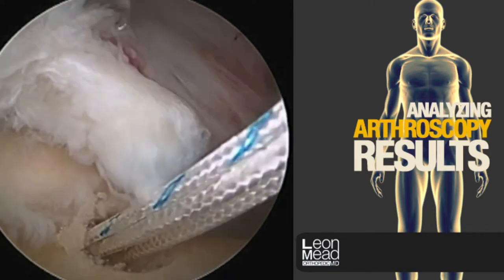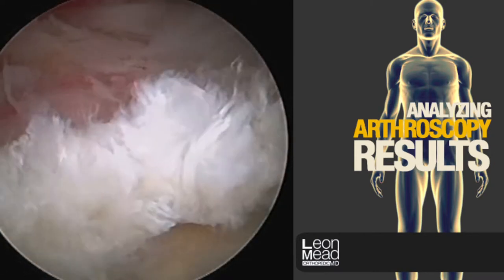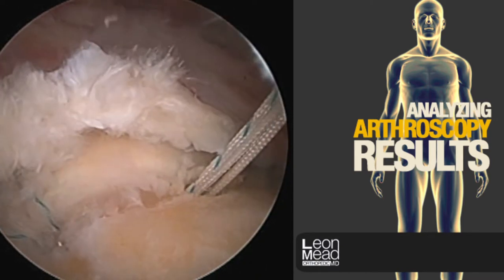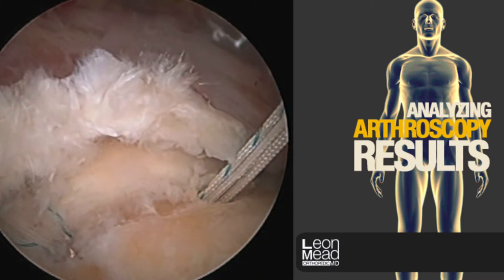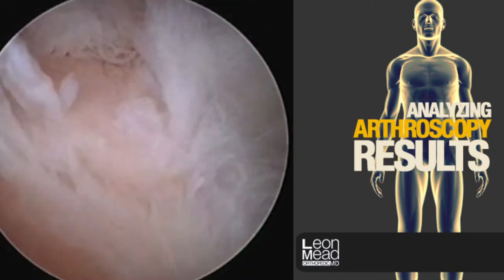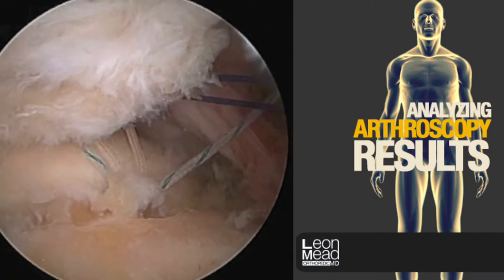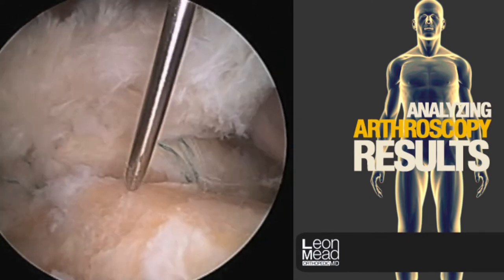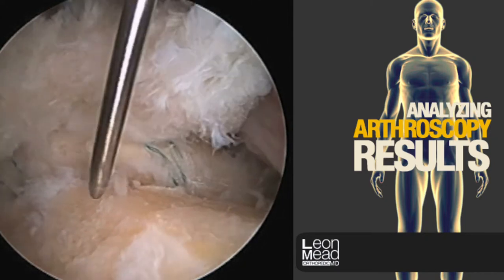The laser lines show the appropriate depth of insertion. The idea of repairing the rotator cuff is to create a mechanical situation where the cuff can heal, but also to restore the normal anatomy and footprint of the rotator cuff tendon.